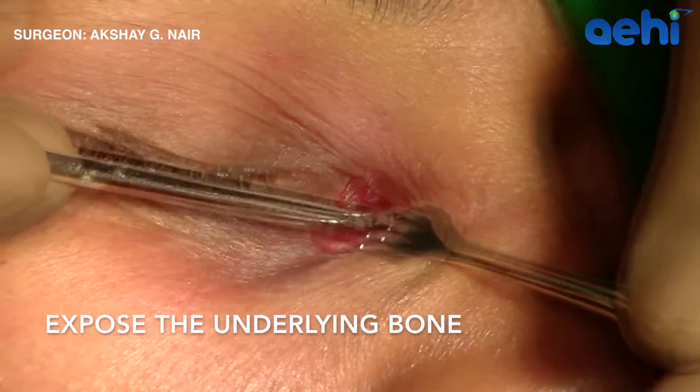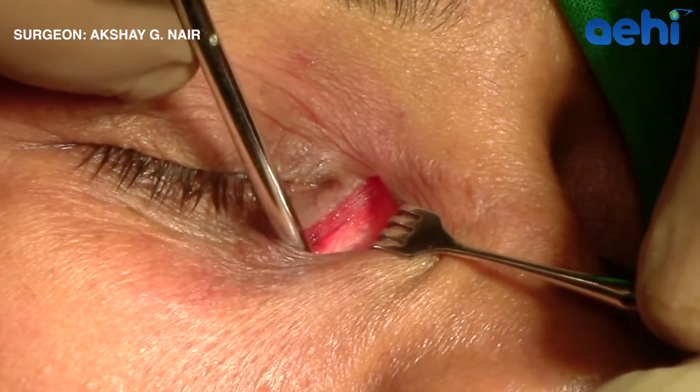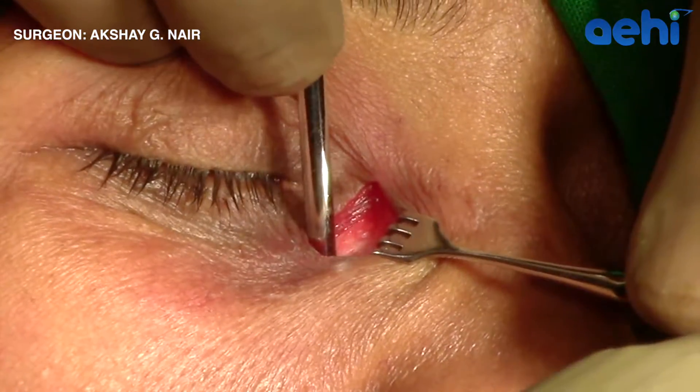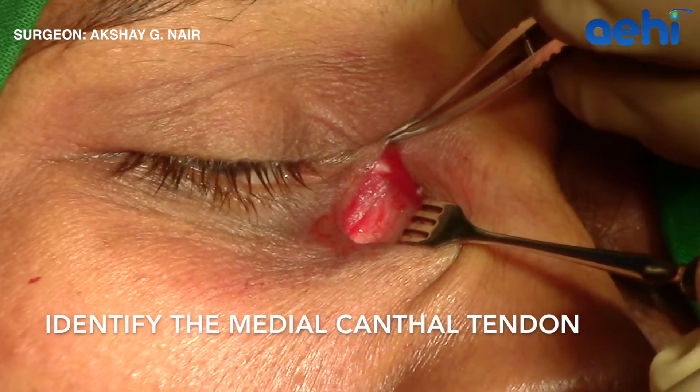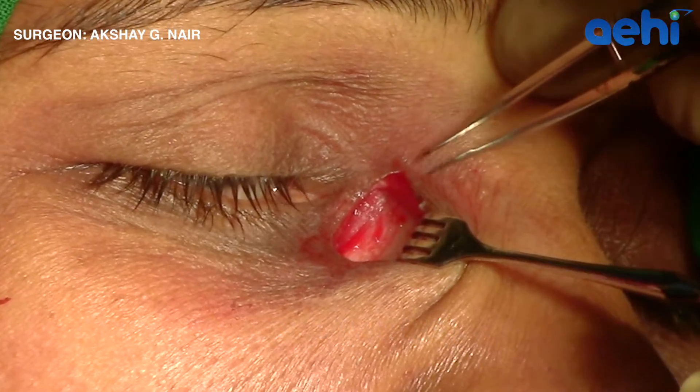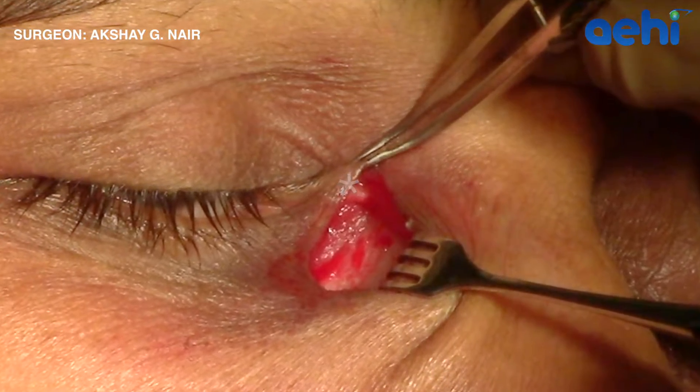Rather than cut the fibers of the orbicularis muscle, I prefer to use a blunt-tipped instrument like the metal suction cannula to separate the muscles that lie over the bone. Here, this white structure is the superficial head of the medial canthal tendon.